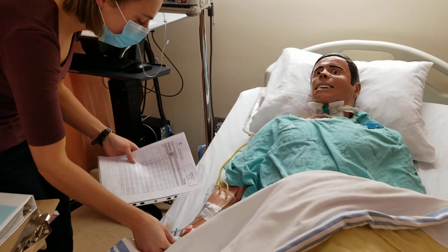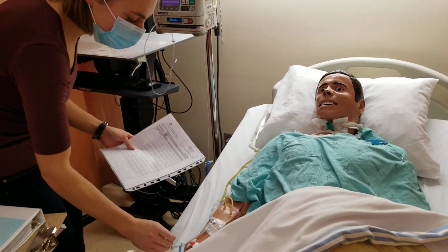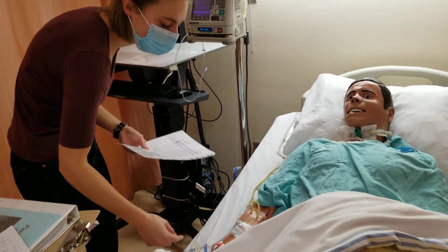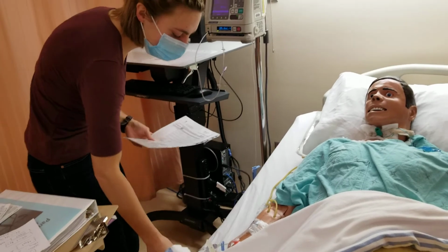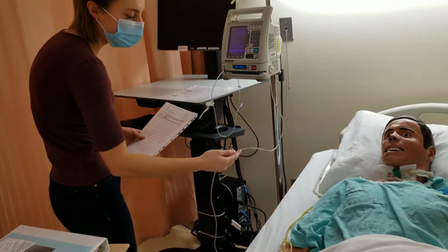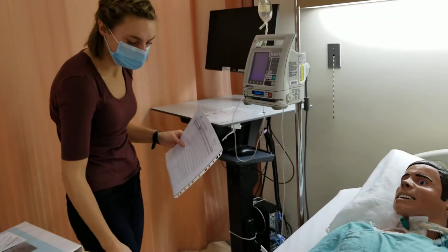Do you have any allergies? Okay, that's what I have here too. And as I'm looking here, I'm also looking at the IV site, looking for signs of infiltration or extravasation. And that's patent, and it is. And I'm looking at the primary line to make sure it's not expired, the tubing or the bag, and that it's running at the right rate.